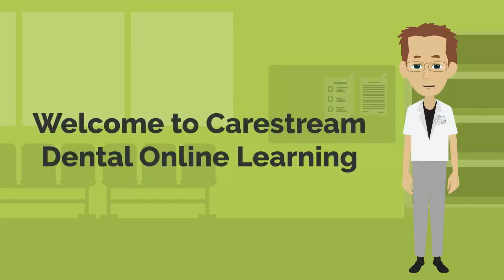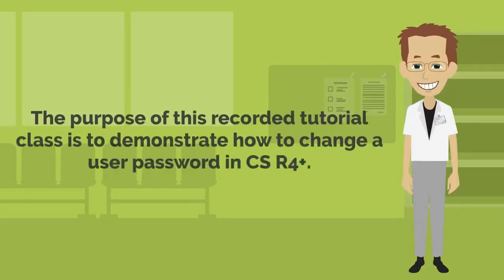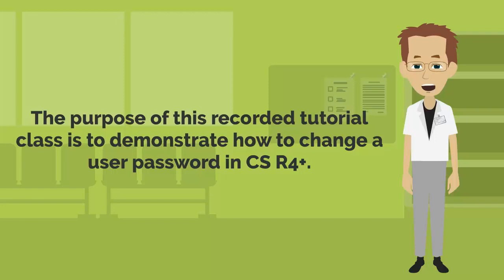Welcome to CareStream Dental Online Learning. The purpose of this recorded tutorial class is to demonstrate how to change a user password in CS R4 Plus.